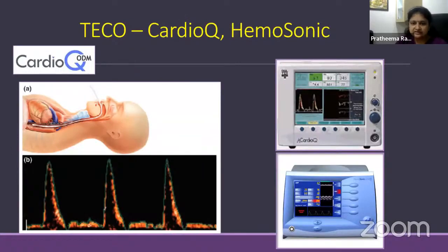So this is how it is seen. The probe is placed in the patient's esophagus. It is looking at the heart. We are not going to get any images, only Doppler graphs. Again, the cardiac output is monitored, and we can see how the change reflects on the blood flow.